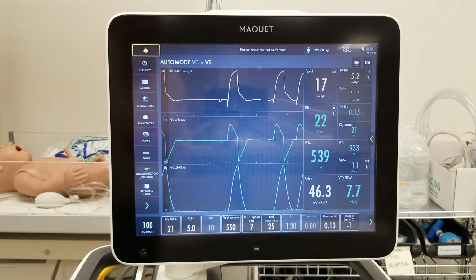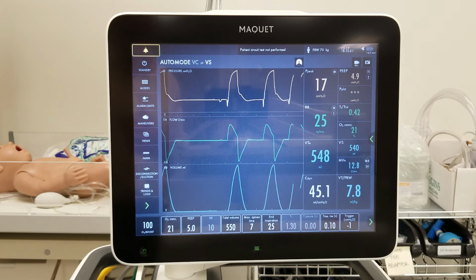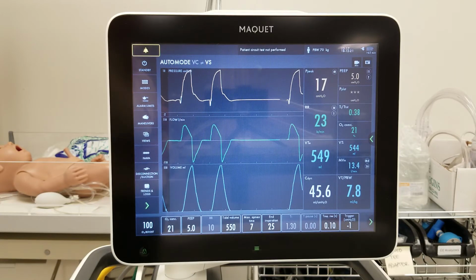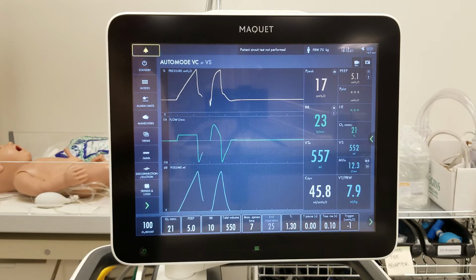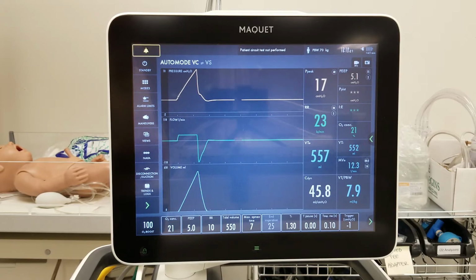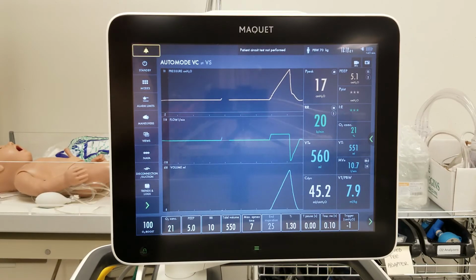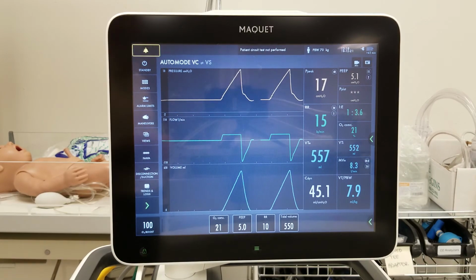hits the max apnea time, which used to be called the trigger timeout. This isn't really apnea. You can't be apnea in 7 seconds. But if the patient doesn't breathe for 7 seconds, the machine will switch back to volume control. So you see 7 seconds. 7 seconds is nothing. People take a sigh and don't breathe for 7 seconds routinely. And so it used to be called trigger timeout, which made more sense to me than apnea time. On the Servo-i, it's still called trigger timeout.